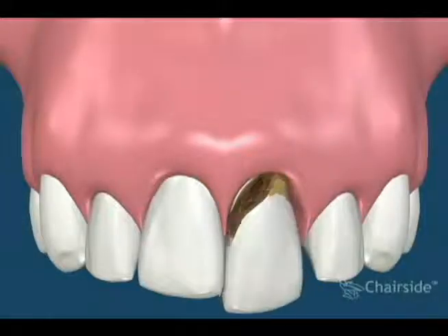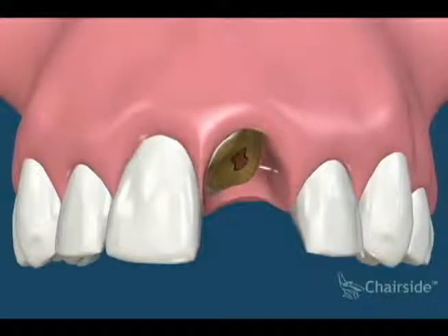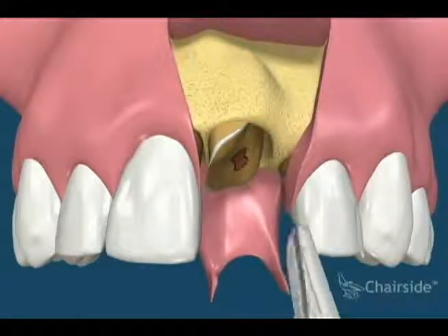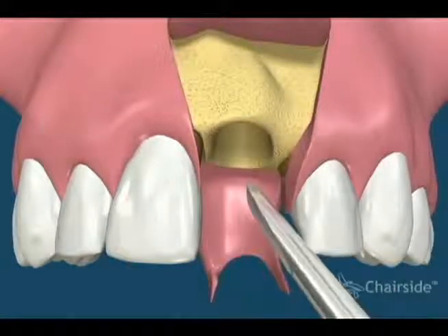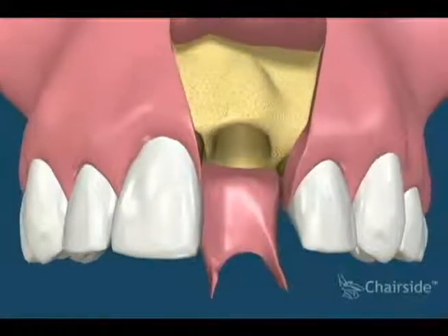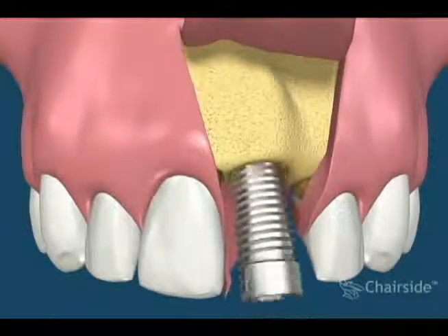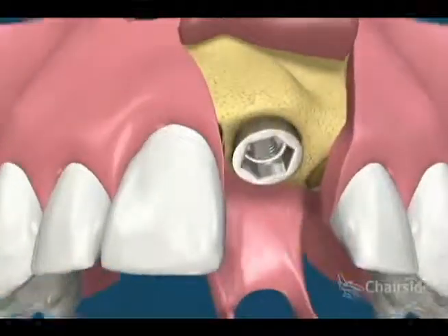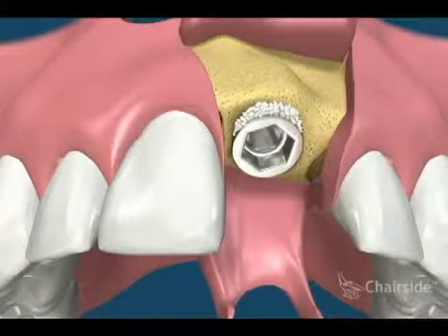This movie shows the extraction of a broken tooth with an implant being placed at the same time as the extraction. The gum is reflected and the tooth is carefully removed without damaging more bone. The void created by the tooth root is now ready to be prepared. The implant fixture is then placed into this prepared site. Note that there is a small void between the tooth socket and the implant fixture.